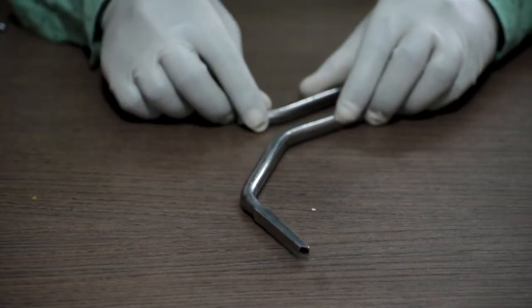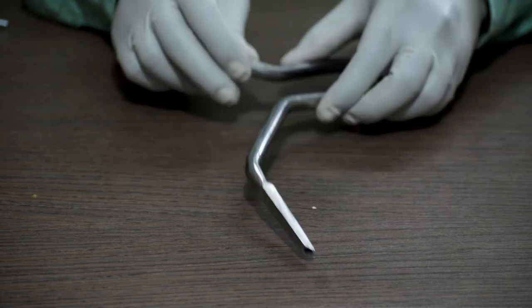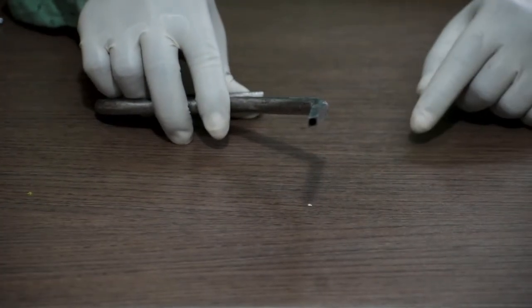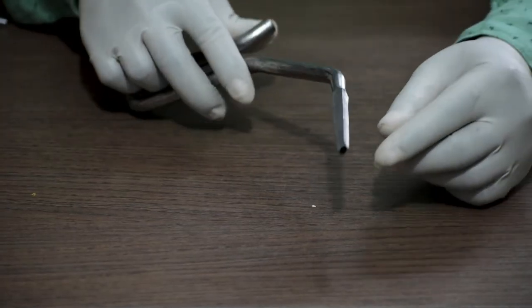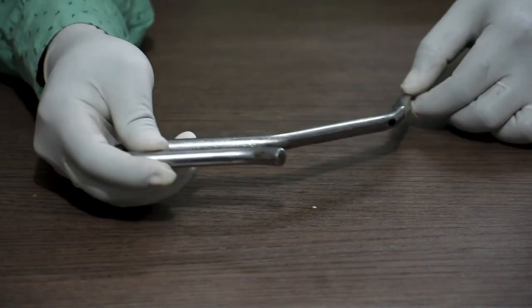And this one is a cannulated awl. As you can see, this is cannulated, so a guide wire can be passed through this. Makes it easier for the guide wire to pass through it.